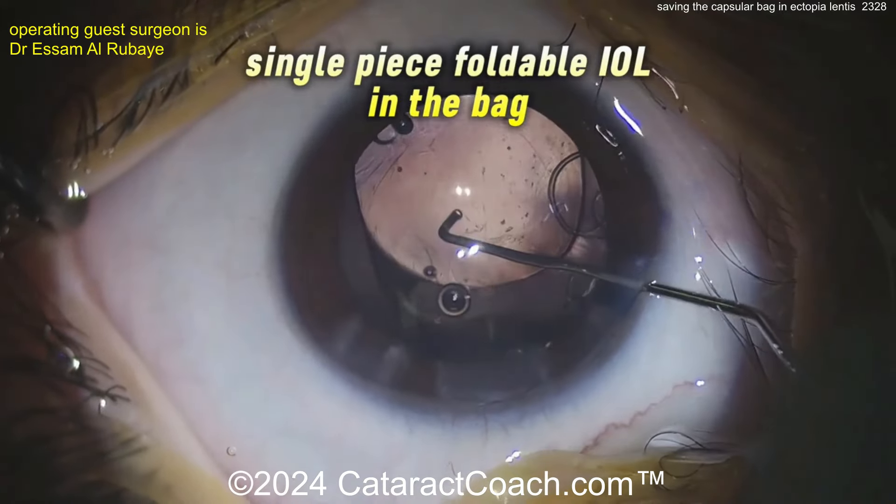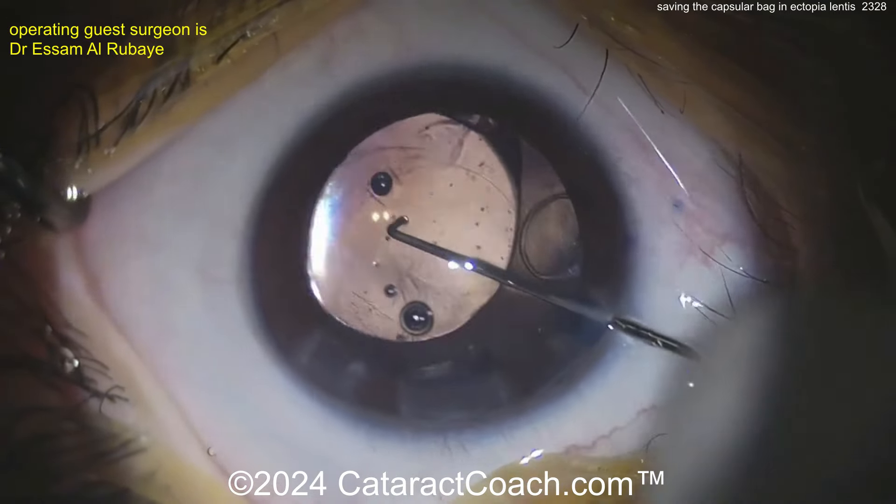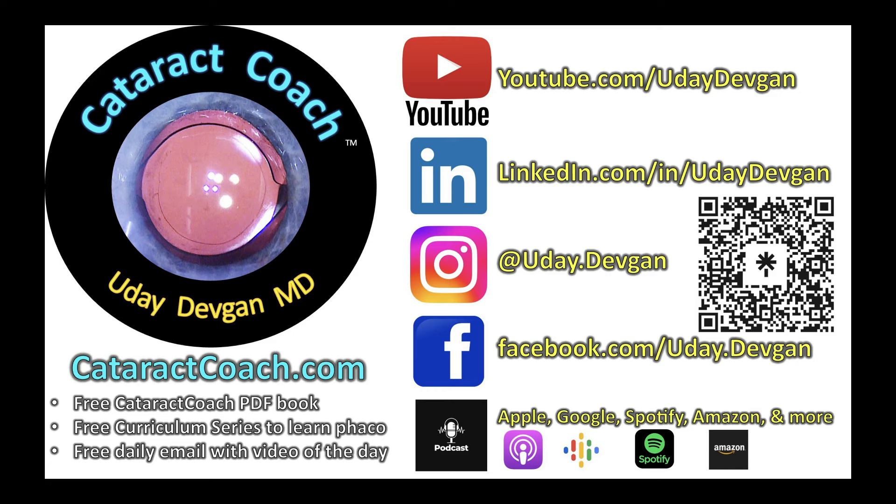Here comes a single-piece foldable acrylic lens going into the capsular bag. Nice and easy — get that delivered and open it up, and the patient is going to have a beautiful outcome. Fantastic job, doctor — thanks for sending the video in. If you want to submit your video, go to cataractcoach.com — there's a link that says 'Submit your video.' We get 30 or 40 videos a week.